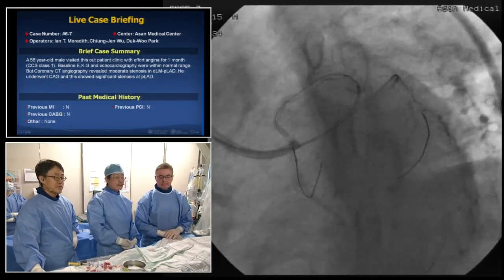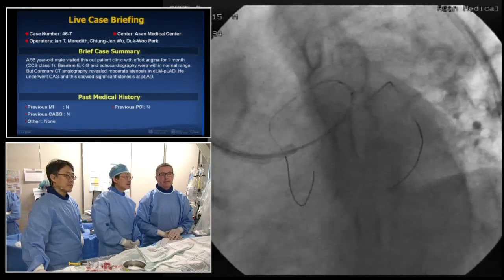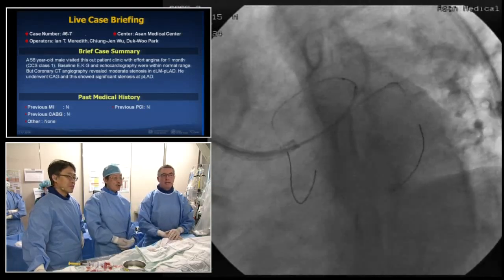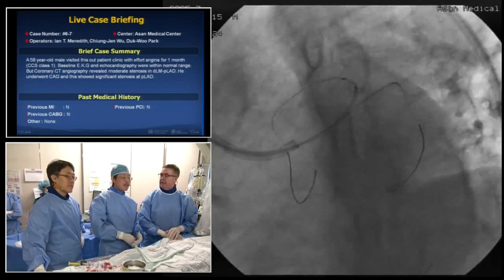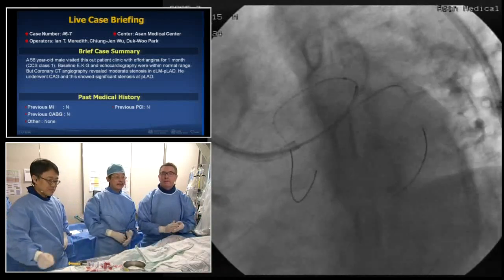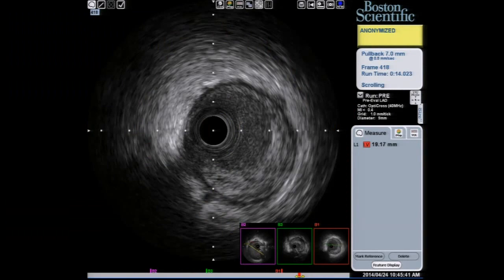Yeah. Before you got on, we had a whole hour of the results from the PERFECT trial and the CROSS trial regarding bifurcation, so it is very timely. So you can tell us a little bit about the strategy for the bifurcation itself of the diagonal, and then we'll talk about the LAD if you don't mind. Okay. Maurice, before we do a strategy, maybe IVUS would help in making a strategy choice. I agree. So that Ken can show what the IVUS was. Beautiful.